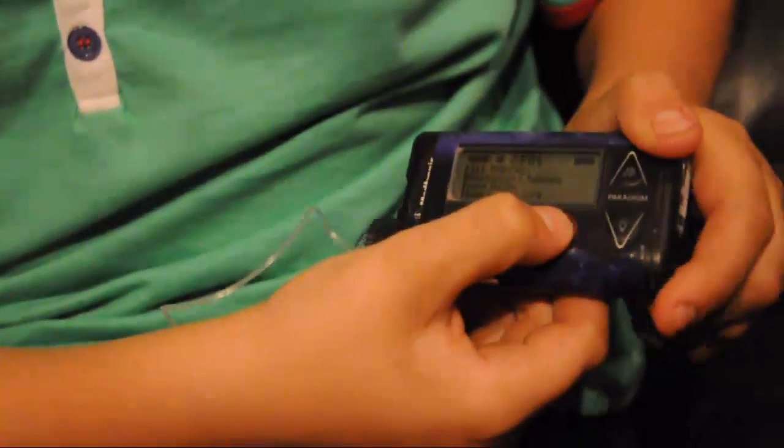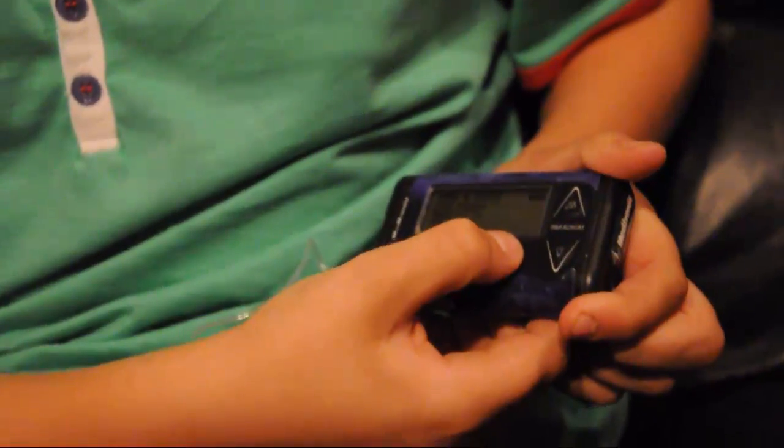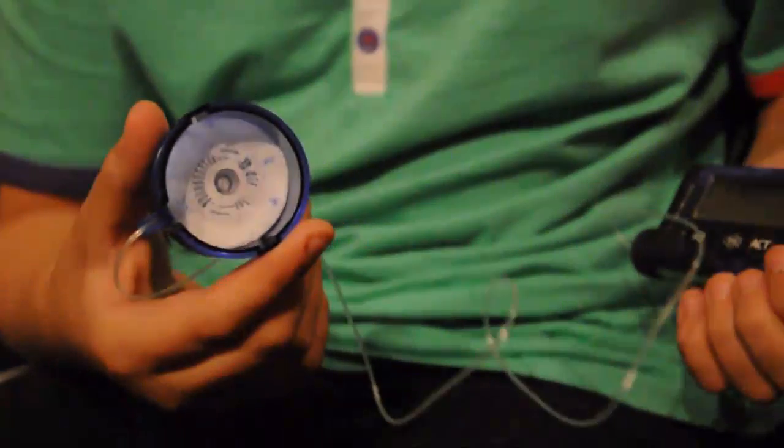And then it says make sure I'm disconnected from the one earlier. And then I need to disconnect the tubing from my body and press act. Am I disconnected? You press yes. Then I need to hold act to fill the tubing to make sure drops come out the end.